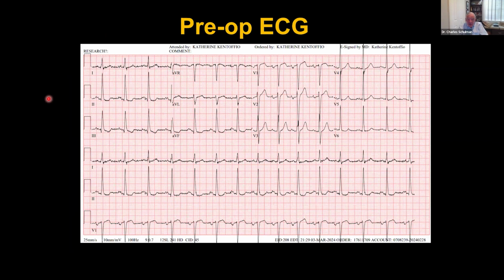All right, the pre-op tracing shows changes which are consistent with left ventricular hypertrophy, and that ST elevation I mentioned, and here's V1 and V2, right?